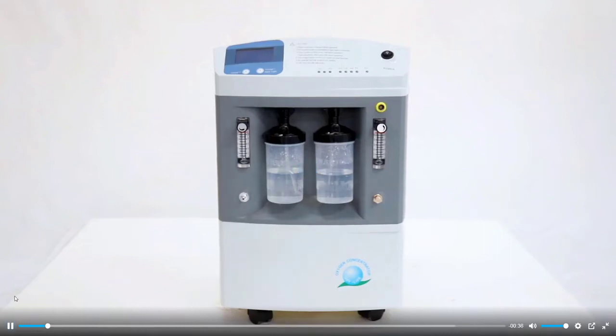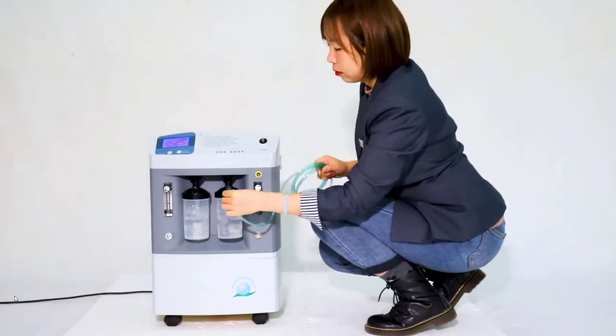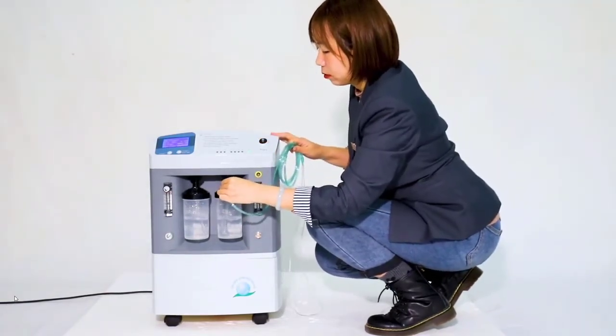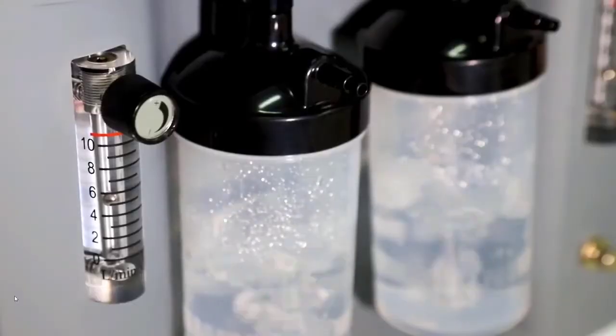Switch on the 10-liter, dual-flow oxygen concentrator. Connect the cannula to the humidifier bottle and wear the nasal cannula.